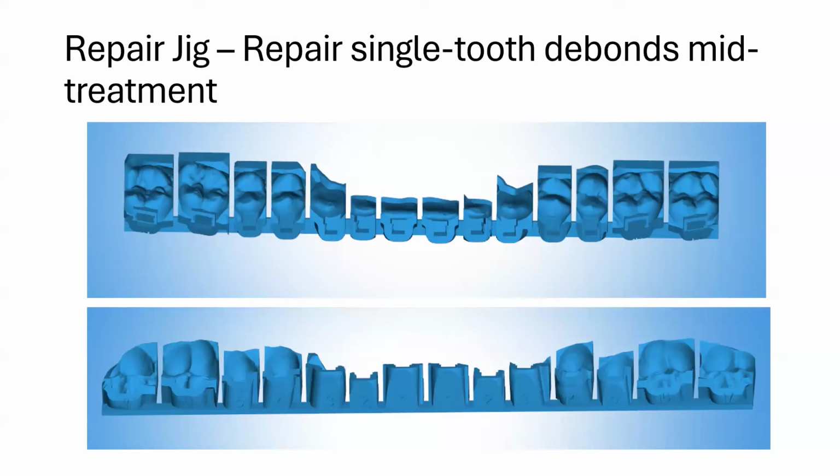Okay, so if we do have a broken bracket, we hand place it and we lose our customization.